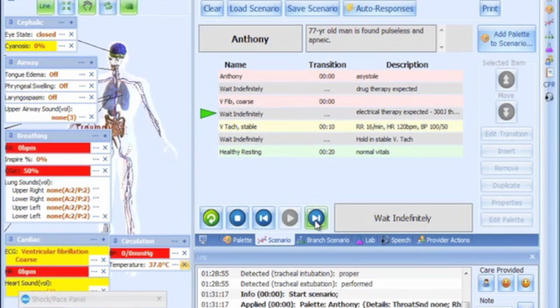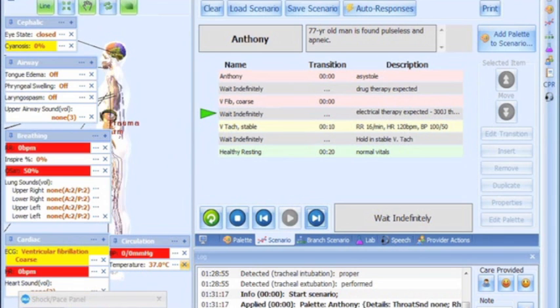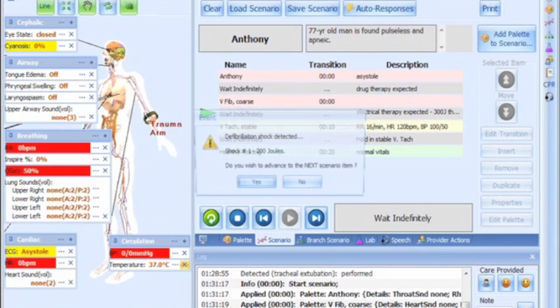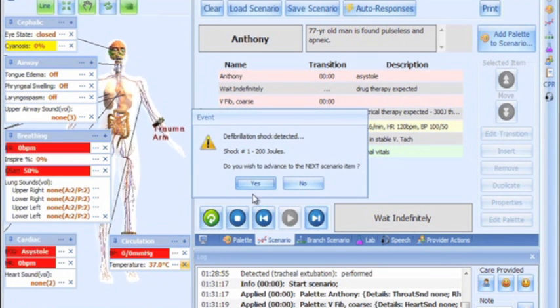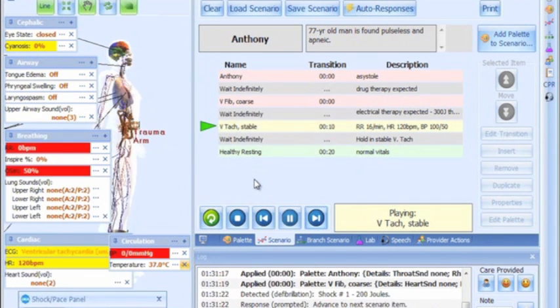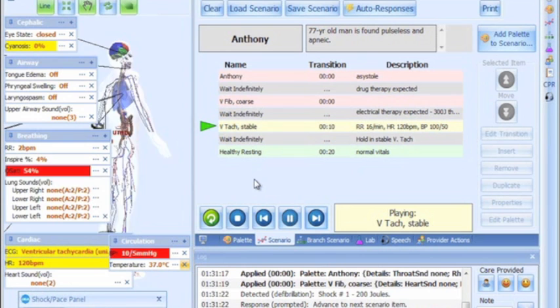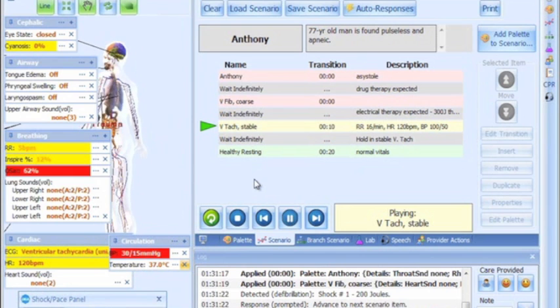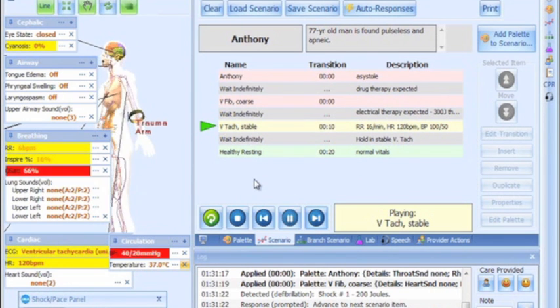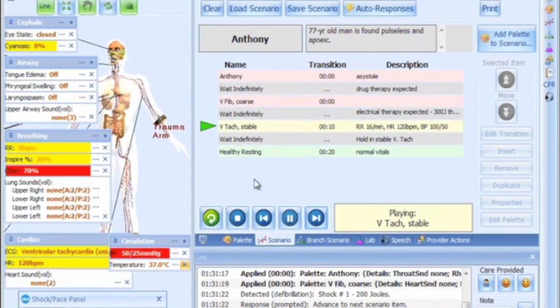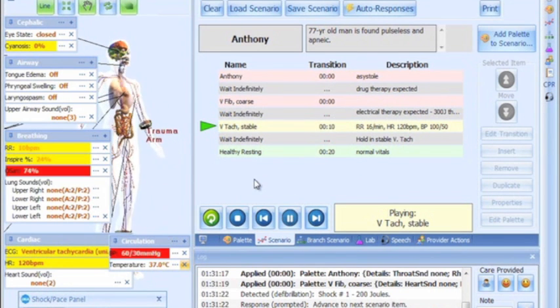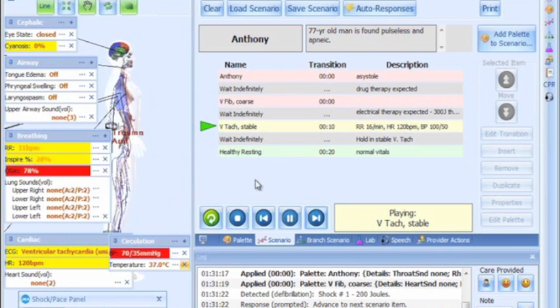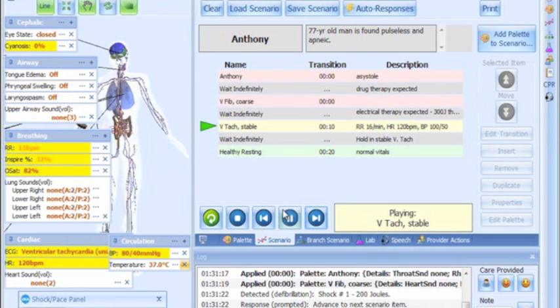With HAL, there are two types of scenarios that can be programmed. The normal scenario is a collection of palette items that play sequentially over a set time period. This is the more straightforward one of the two scenario types.